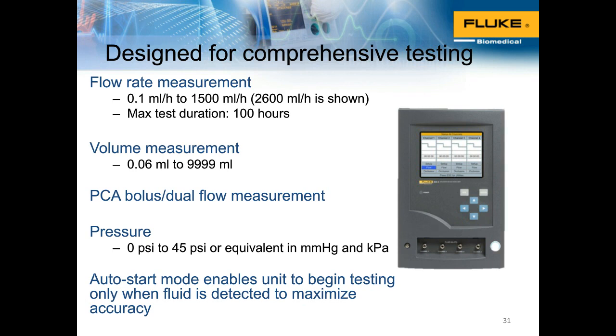It also has an auto start mode, and the auto start mode actually makes the infusion device analyzer even more accurate because it will only start testing once it detects flow at the inlet. So let's say you push start on the infusion pump and then you push start on the infusion device analyzer, or vice versa. The only time it's going to start the measurement is when it detects the fluid. So it makes sure that every single drop is being counted when it's giving you the reading for the flow measurement.